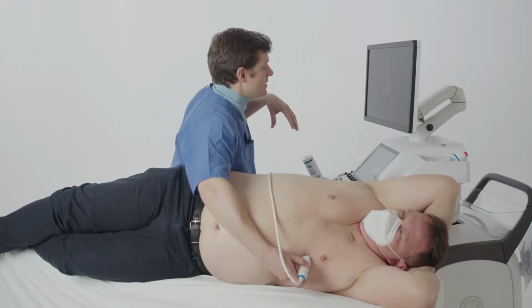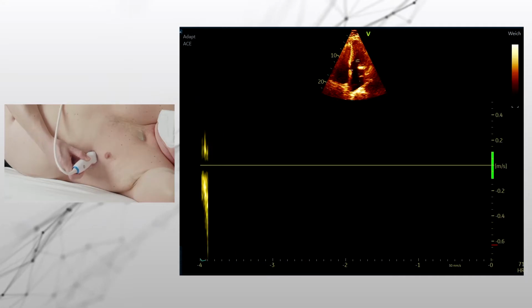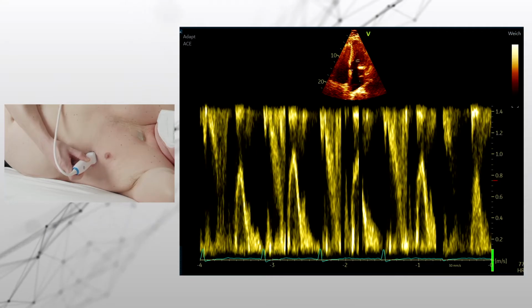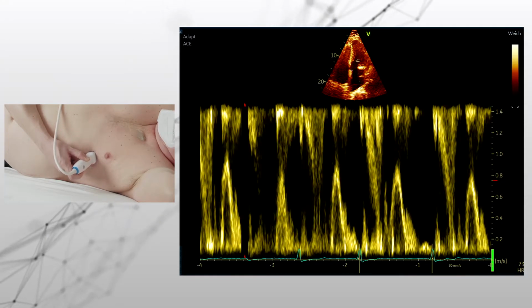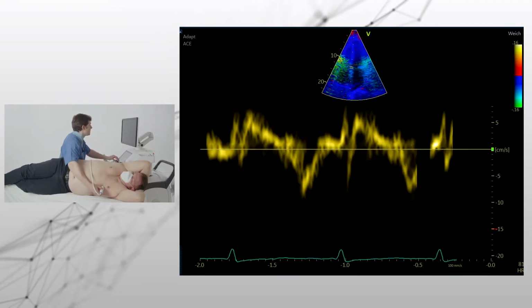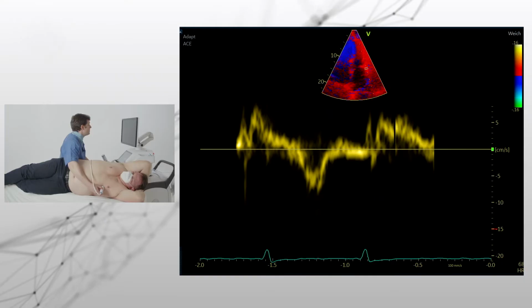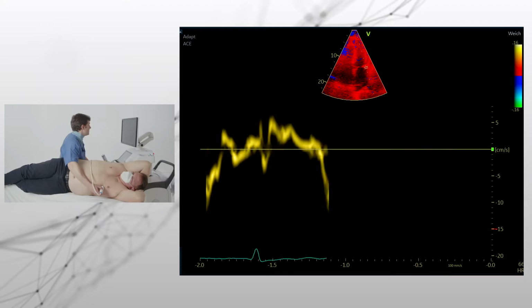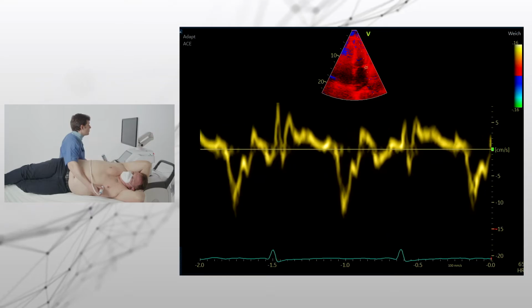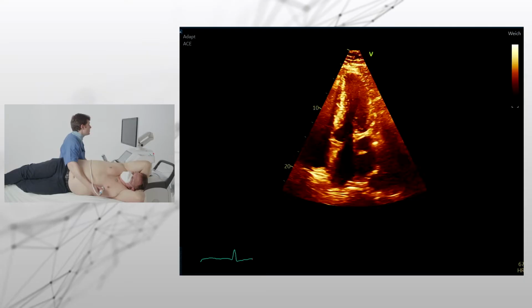The one thing that is still open is one thing you can sometimes easily forget: diastolic dysfunction. We also want to see it in this case, and we have the E-wave we have to measure, and of course we need to use the tissue Doppler, not only for the right ventricle but also for the left ventricle. Here we have the E' medially and the E' laterally. And you also hear that's a nice tissue Doppler signal, and I always have more than one signal to compare in atrial fibrillation, where you should take the average signal overall.